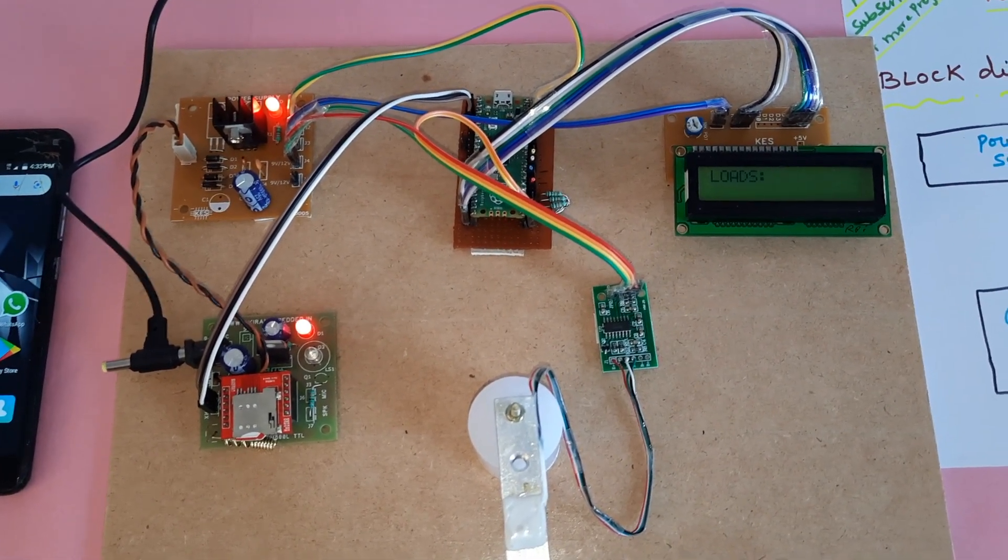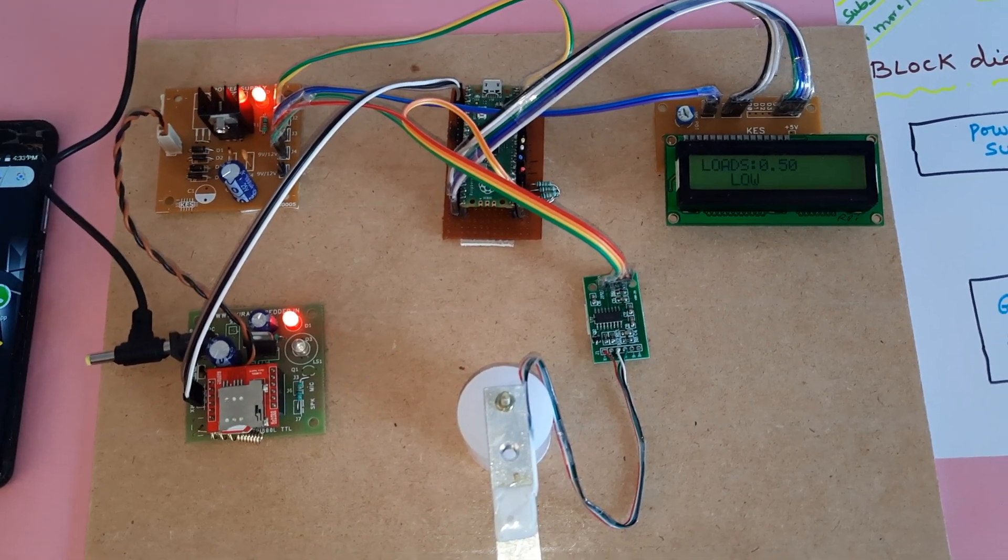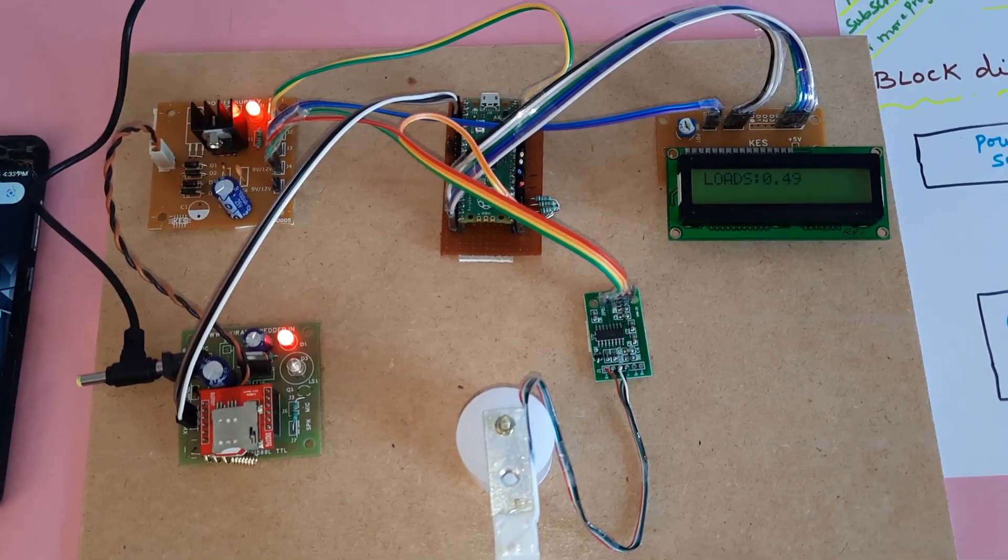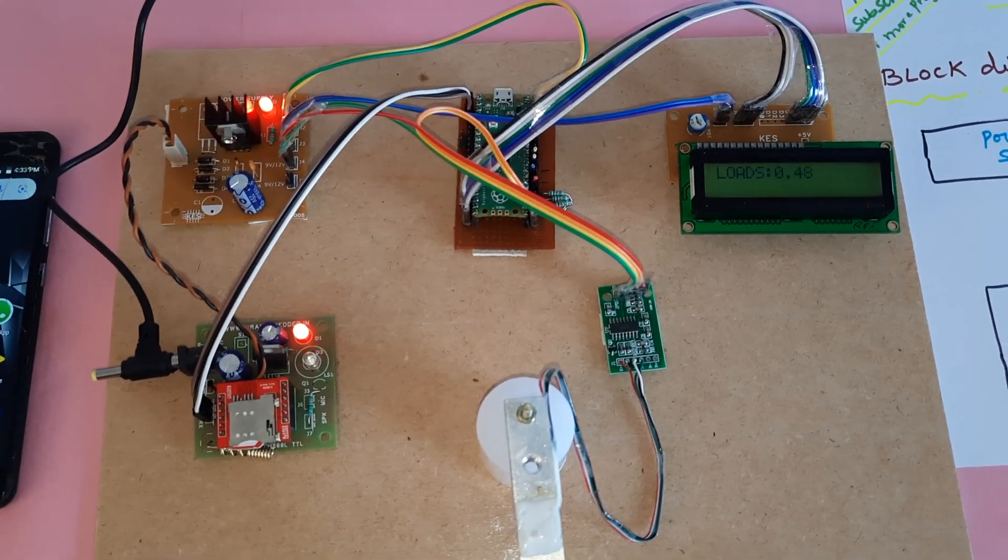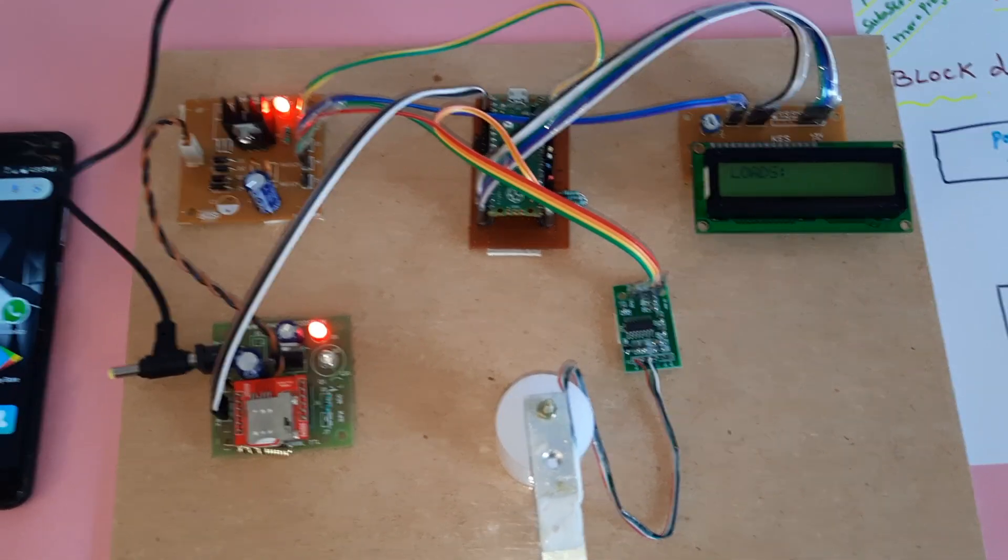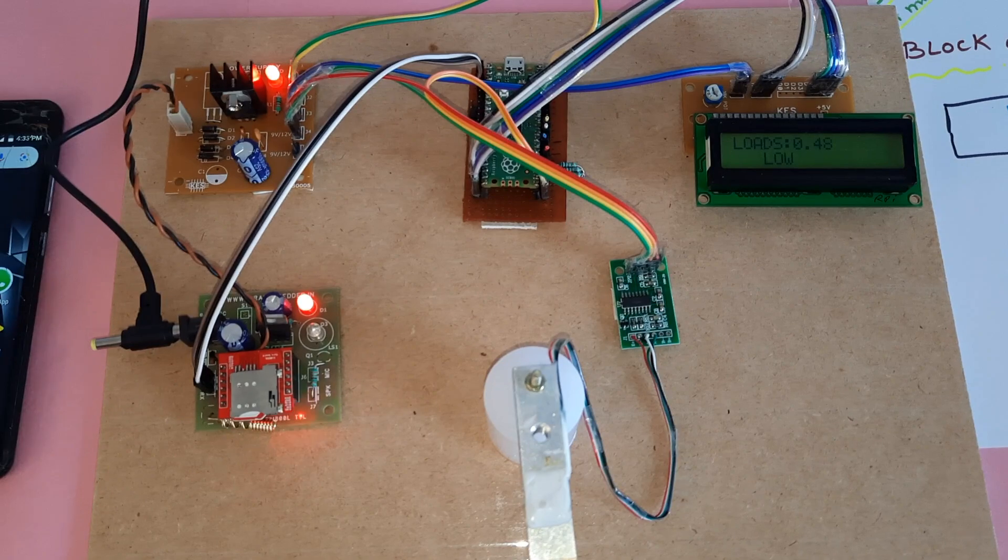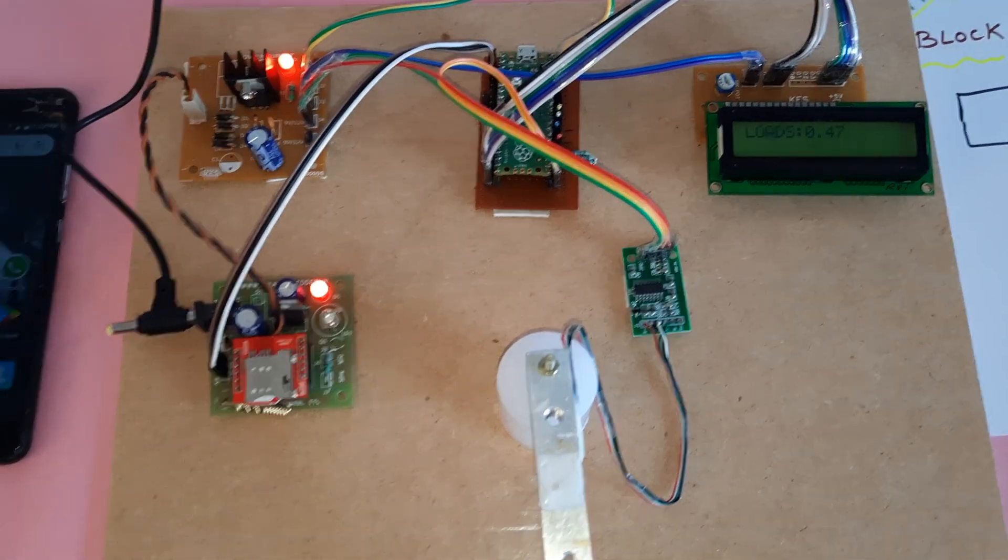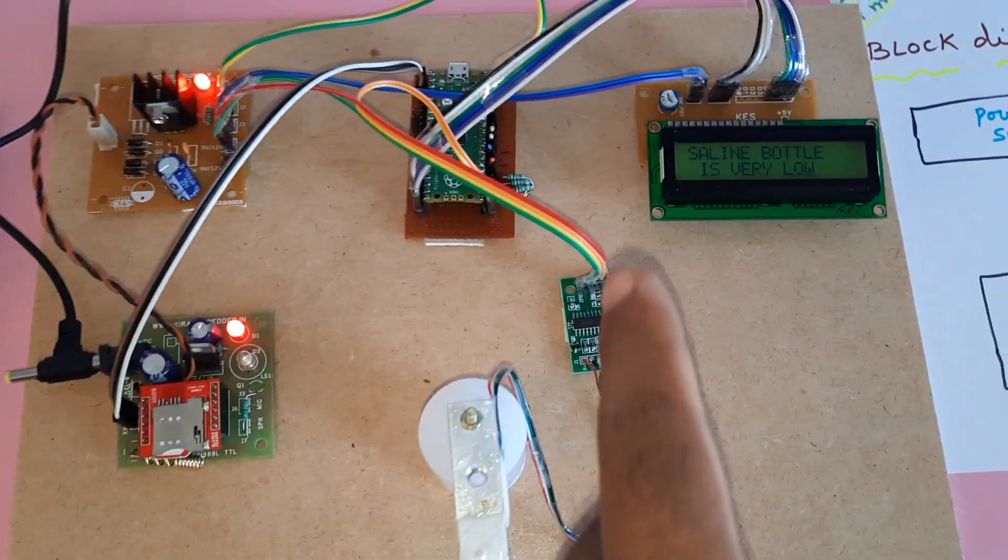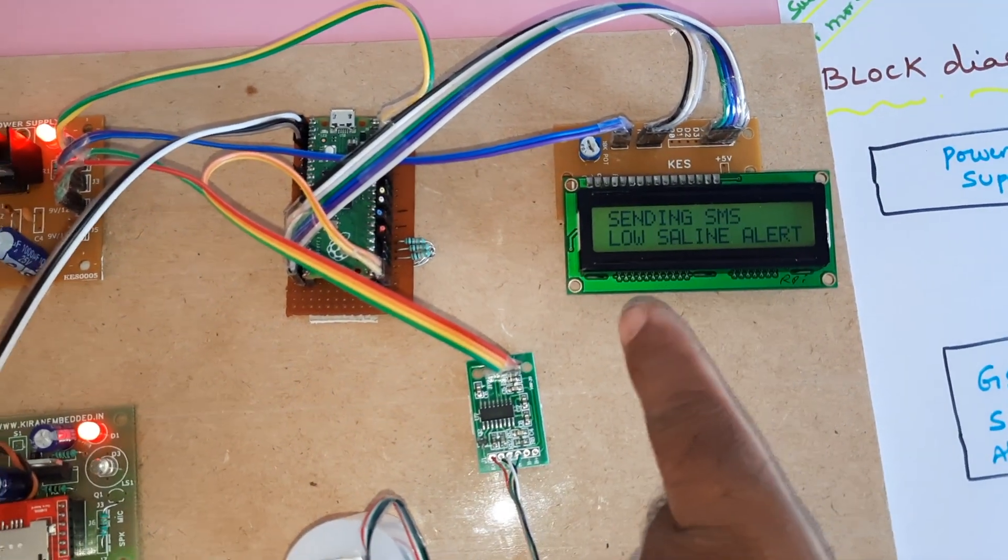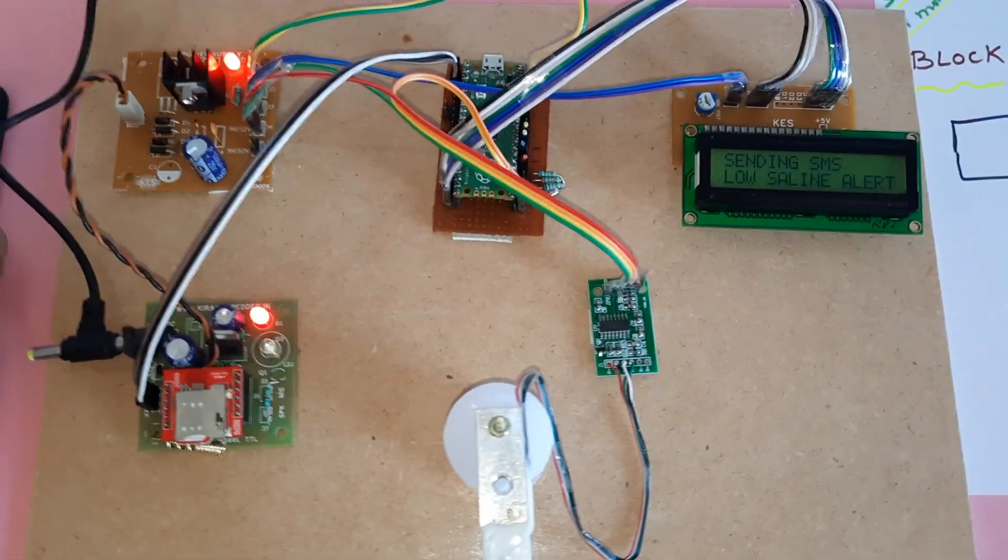It's now at 50 and below. After the fifth count, it will send the SMS alert to my mobile number and the student's mobile number. The system detects the saline bottle is very low and is sending the SMS alert.